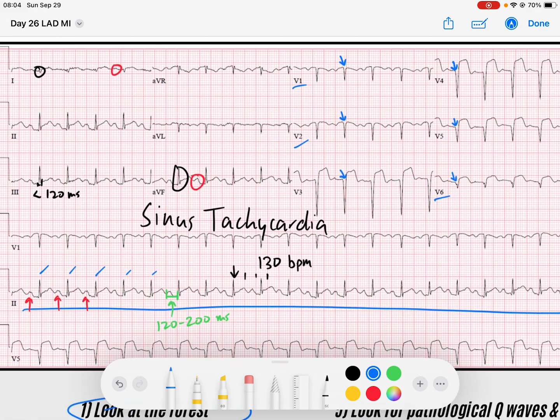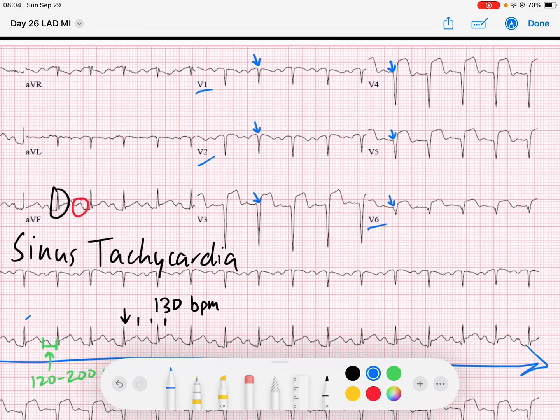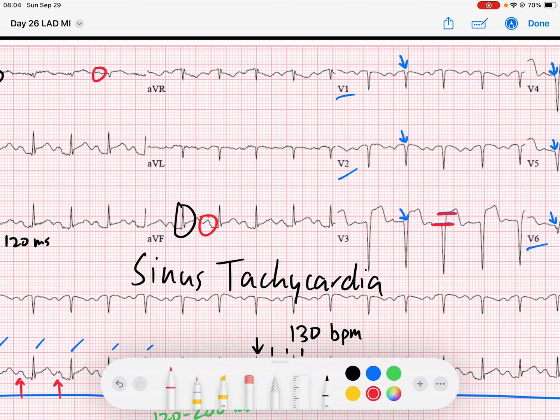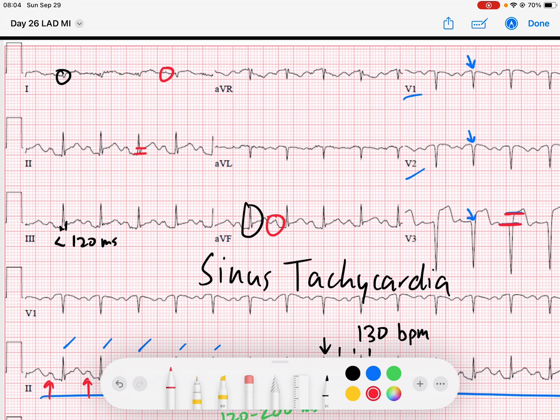The next thing I do is look at the ST segments. I notice in V3 we've got ST segment elevation. V4 has the most ST segment elevation. V5 has ST segment elevation, and a little bit in V6. You can even see some extension to leads II and AVF, and to a lesser degree lead III.